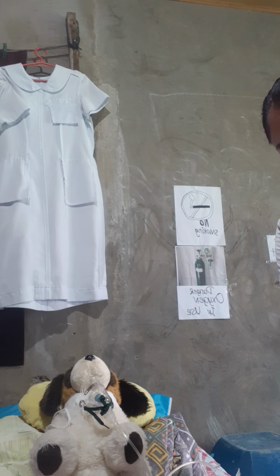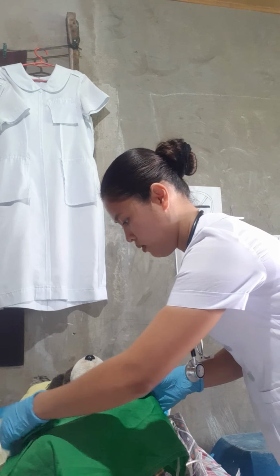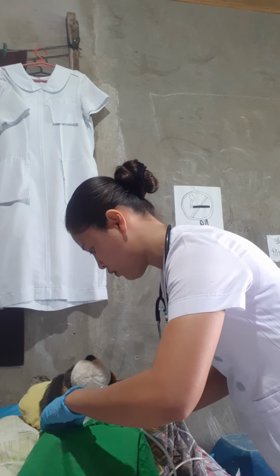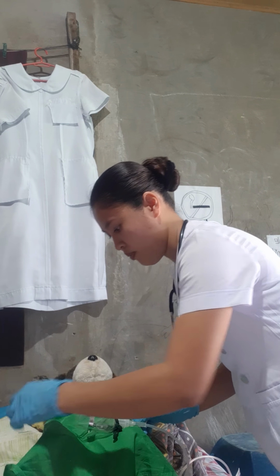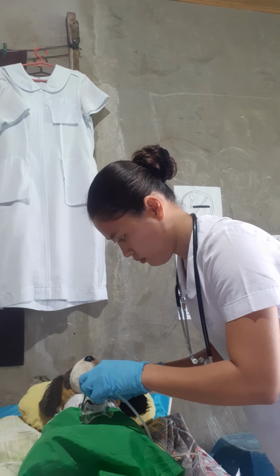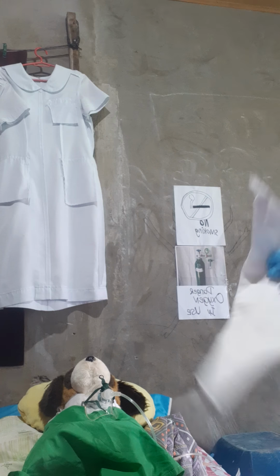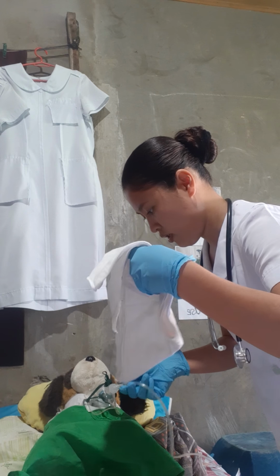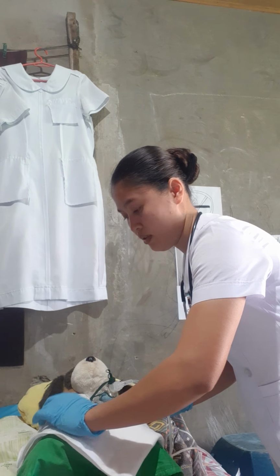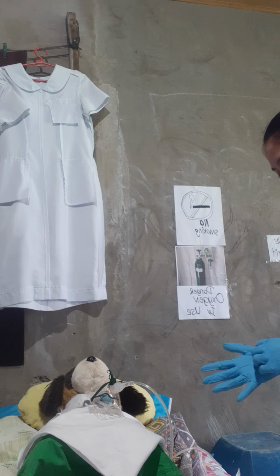Before we proceed, I'm going to put this rubber pad on the client's chest, so that if the secretions are excreted later, he is safe from soil or infection.